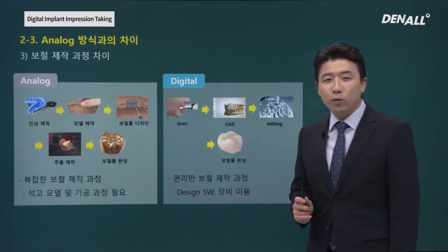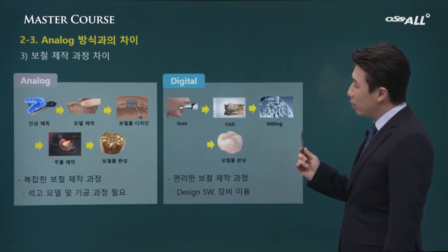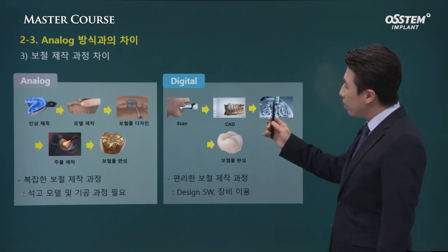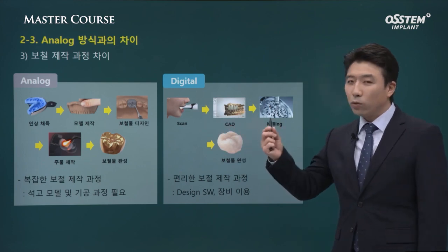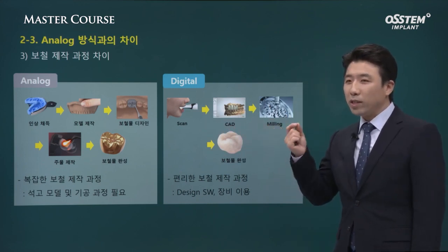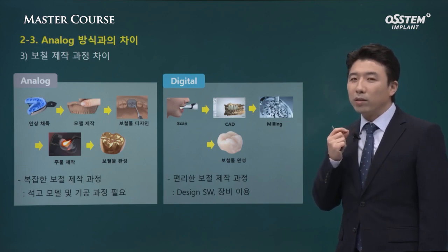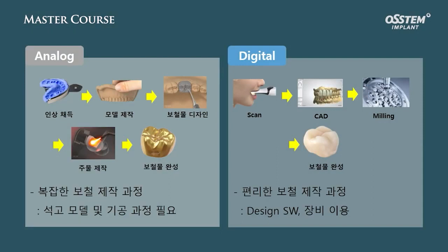Lastly, summary. Comparing analog versus digital. Using scan data by exchanging files through good communication with the lab, a dentist can check the design and others.